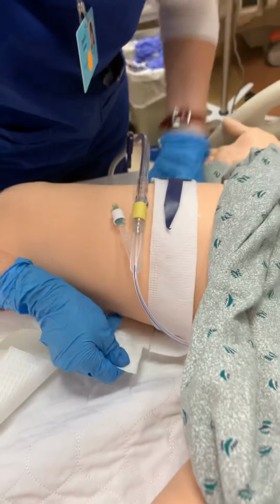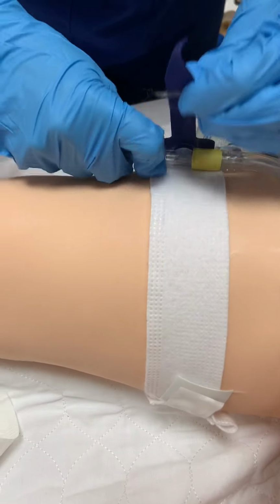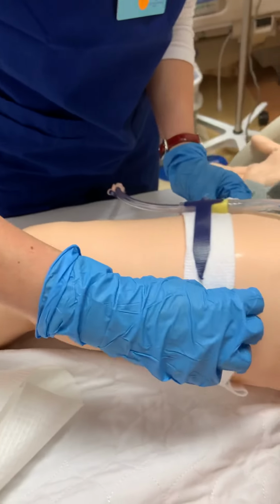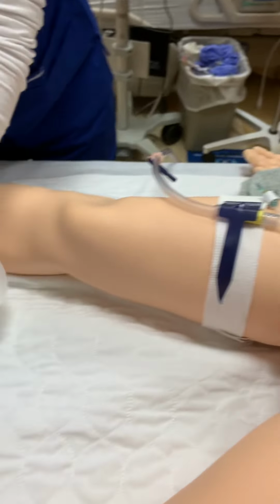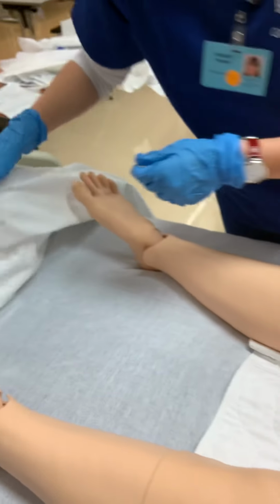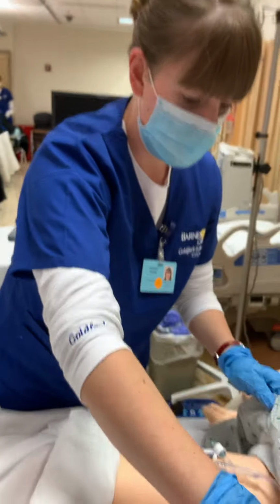Can you help me with that leg, lifting that up a little bit? Okay. All right, perfect. Still have a little bit of slack in there, so that's good. Okay. All right, I'm just going to clean up a little bit real quick and get you a little bit more comfortable. Would you like me to put this back up for you? Yes, please. Okay. All right.